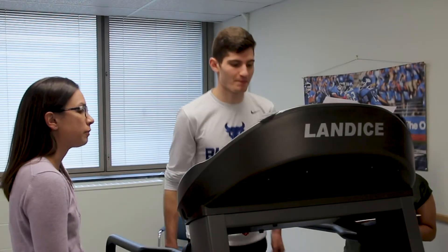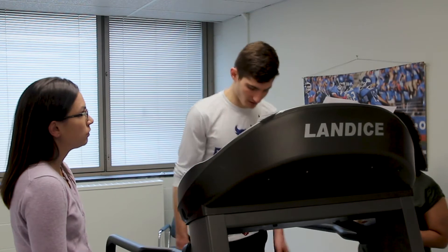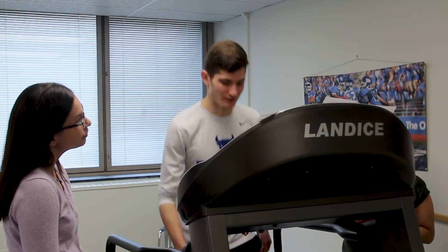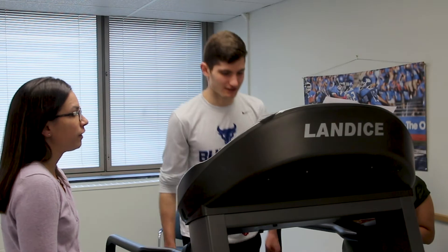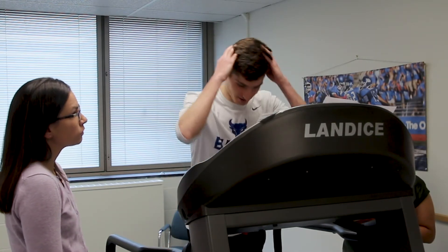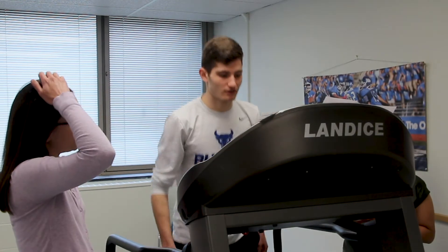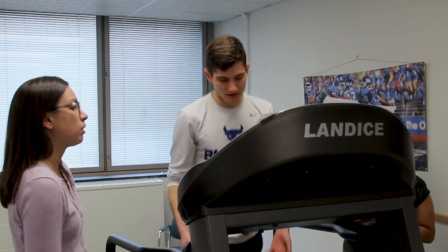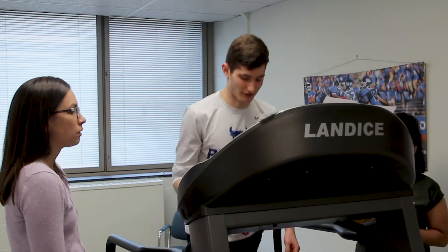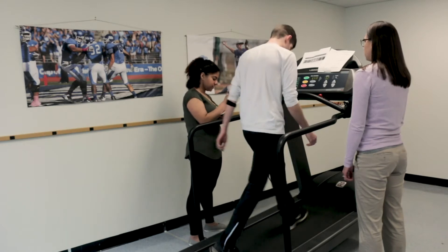While the patient is on the treadmill, the primary thing we're looking for is symptom exacerbation. We use the visual analog scale — the FACI scale — to assess that on a regular basis, but we also observe the patient. We're looking for distress, how they feel, whether they can continue the conversation, and so on. It's as much a clinical observation as it is a numeric one.